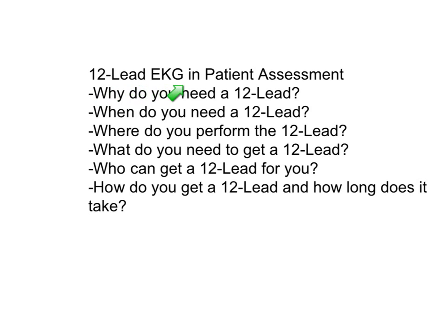So why do we need one? Again, high definition and then more views. The limb leads give you 3 or 4 views. The 12-lead is going to give you 12 views of what's going on in the heart.